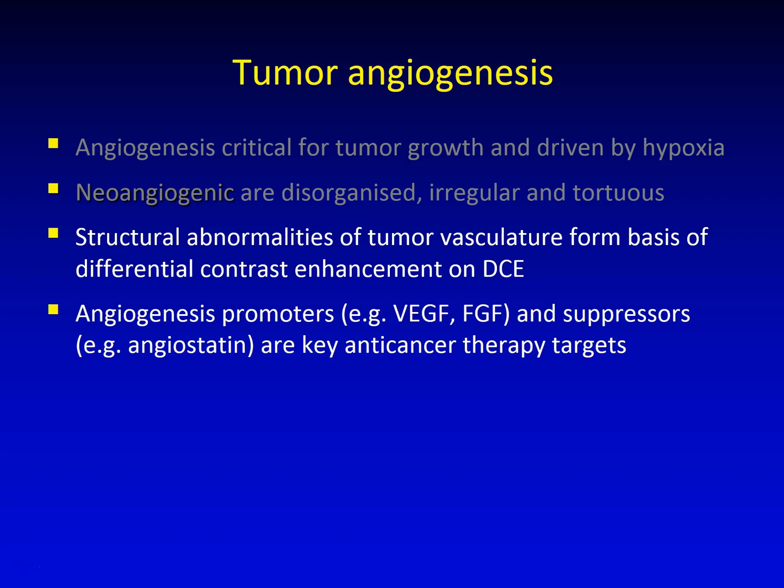These structural abnormalities of the tumor vasculature form the basis of the differential enhancement that we see on dynamic contrast-enhanced CT and MRI.